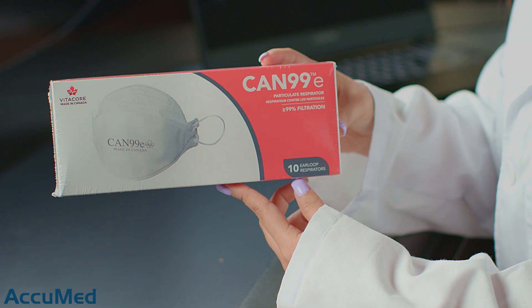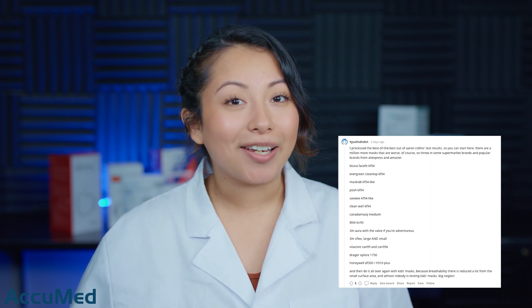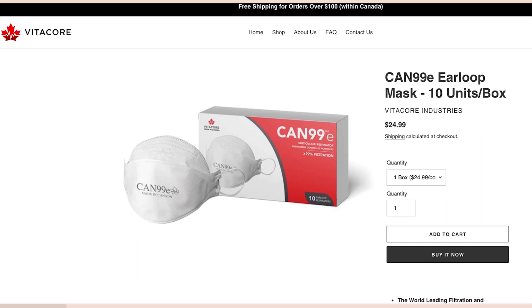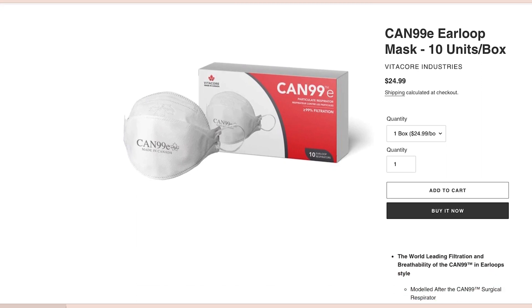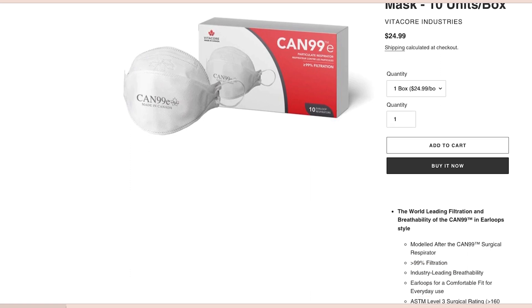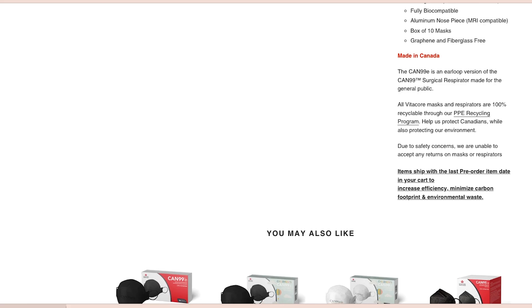Hello everyone and welcome back to the Acumen channel. Today we're going to be reviewing the Vita Core CAN 99. This mask review was requested through Reddit, so thank you guys for the suggestions. Here is the listing — we purchased them from the actual manufacturer's website. These are the CAN 99E ear loop masks; they come in a pack of 10 for $24.99, making them $2.49 each. The listing doesn't have any ratings or reviews.